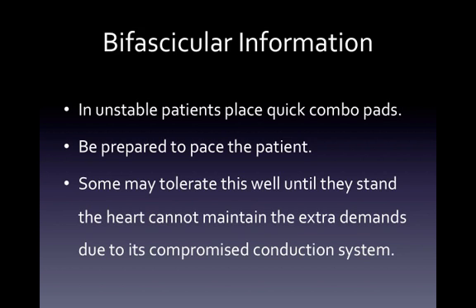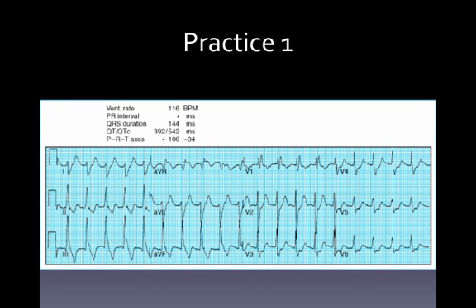Okay, so we're going to go through the practice here, and we're just looking at two locations really quick. I'm going to show you where the machine comes out with the axis. These are three numbers here that the machine figures the axis for. Now, we're going to plot it and show you two different ways of determining this. The first way is to look at what the machine came up with. The machine came up with 106.